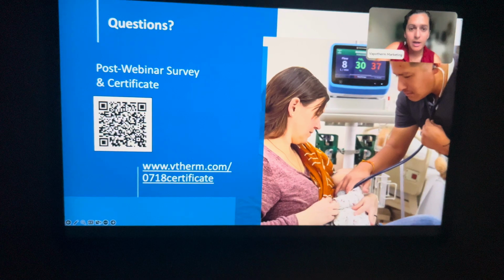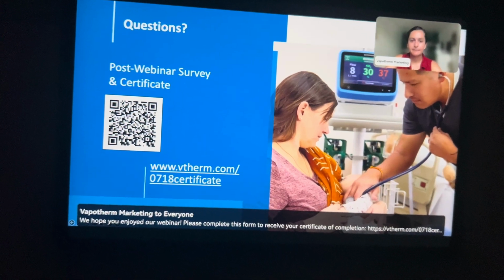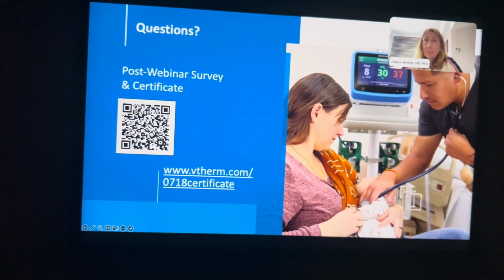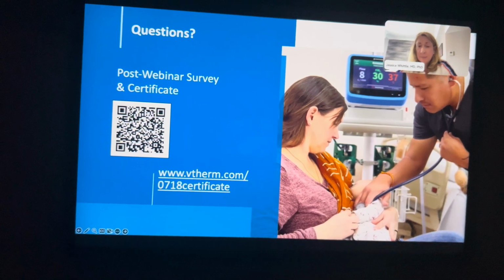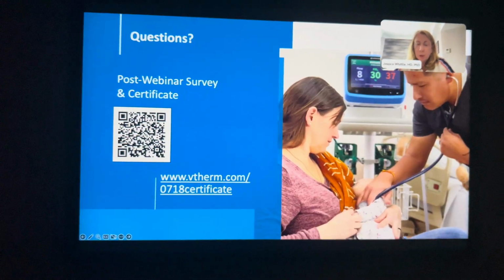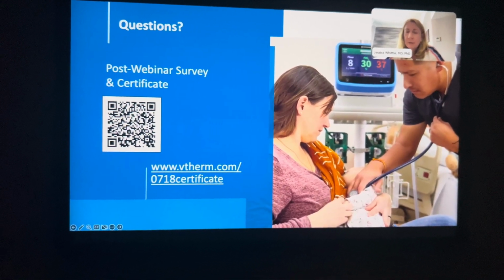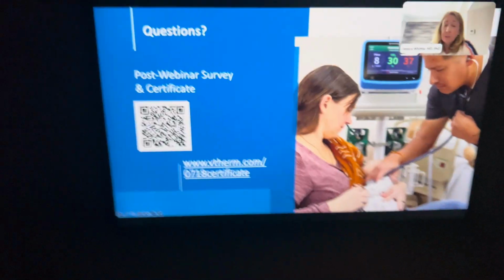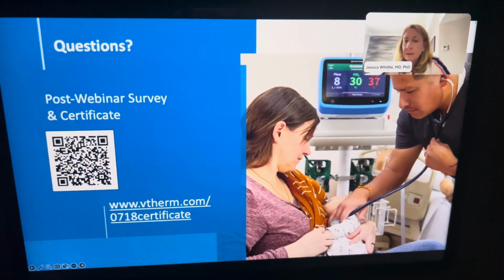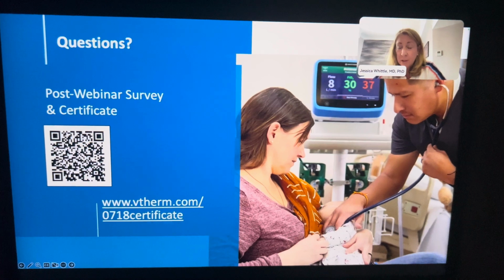And we did get a question here. Will the patient get a lower oxygenation level if they are mouth breathers? So really great question. It doesn't have a simple answer because it depends a little bit on how much they're breathing and how fast your flow rate and those things. But in general, in most circumstances, if patients are breathing at physiologically normal levels, the speed of the gas is so quick that most of what they will inhale will still go in through the cannula, and I would expect them to get fairly close to the same oxygenation level.